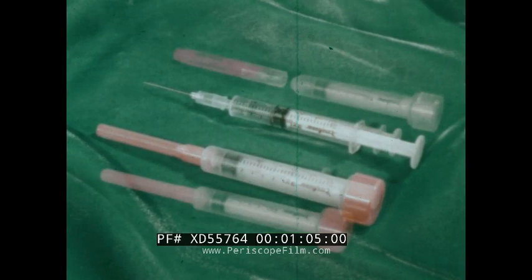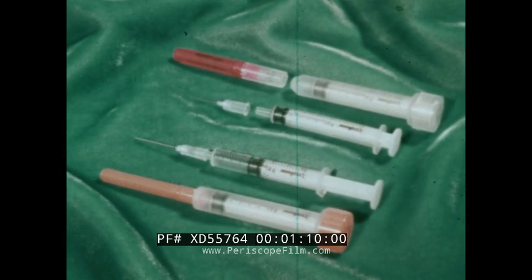The Monoject sterile platform system is an integral part of the Monoject syringe and needle unit. The component parts of the tamper-proof Monoject rigid package, which protects the sterility of the unit, have been designed to make the sterile platform technique possible.